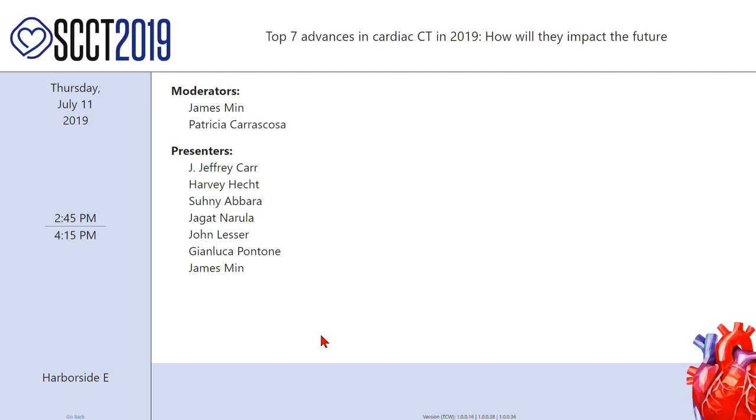Yes. So there are some slides that unfortunately I didn't get to out of time. The possibilities are endless. You can differentiate calcium from iodine and remove them. My question for you would be, well, but the blooming artifact, that's not reality. Are you removing the blooming corona as well? Wouldn't that cause error? We're doing something that is called CT fingerprinting that will help differentiate true calcium from iodine.